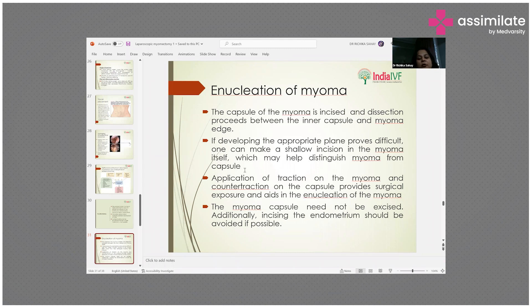Application of traction on the myoma and counter-traction on the capsule provides surgical exposure and aids in the enucleation of the myoma. The myoma capsule need not be excised additionally. Incising the endometrium should be avoided if possible.